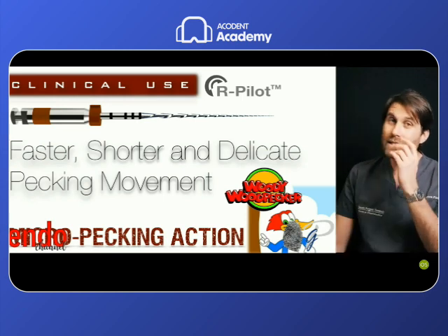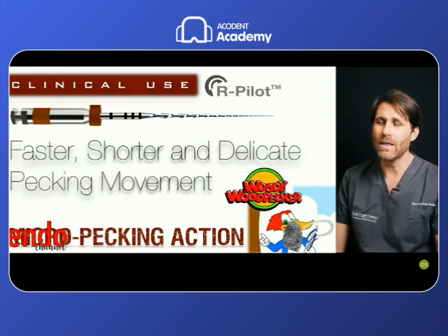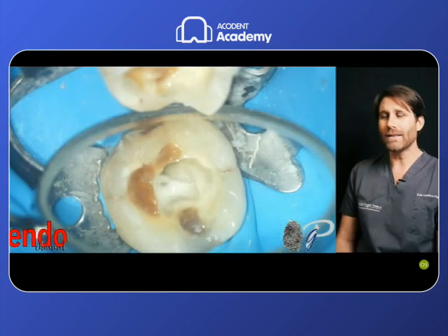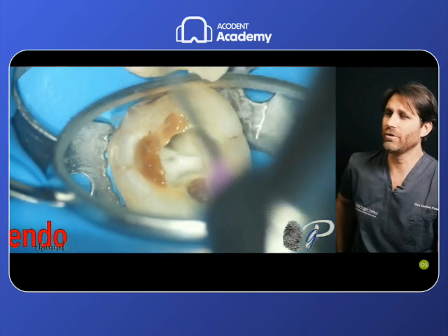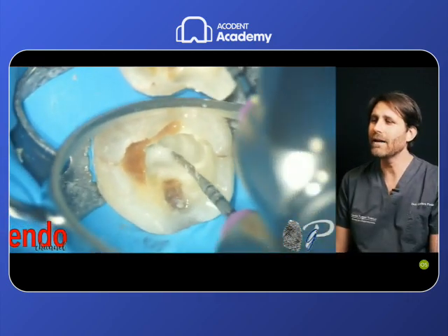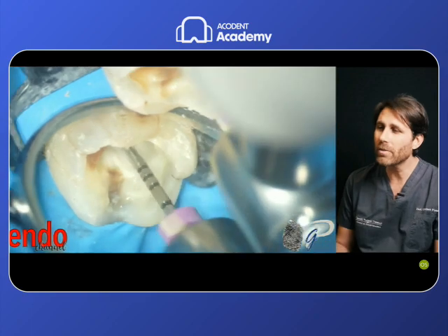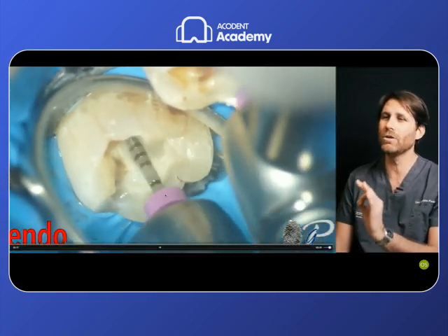That means that in this case, where we have not scouted the root canal with hand files before, we need to adapt our hand movement a little bit. And this is the movement that we like to perform in this case. We insert the file inside the root canal, not in reciprocation, and then we reach the point at which it may bind, and we start the motor movement. As soon as we start the motor, we perform this up and down, short and fast movement, just pushing a bit on the tip of the file.